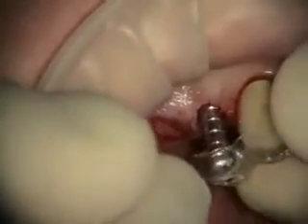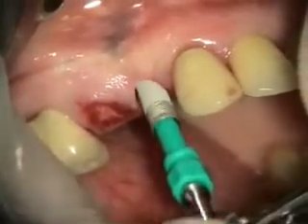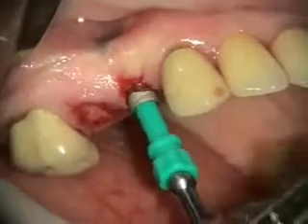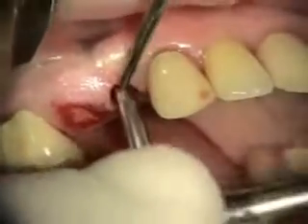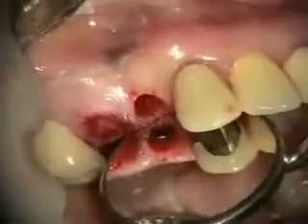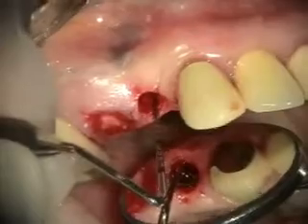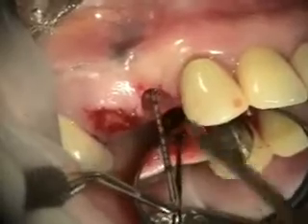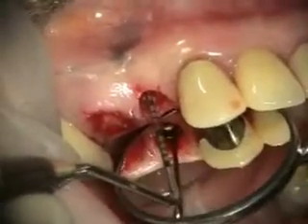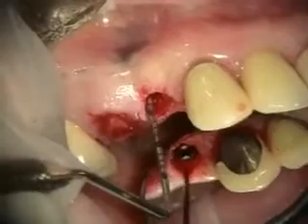You can see we're angled a bit toward the facial, and the reason why is because there's such a depression here. You see the edge of the bone is here and then the edge of the implant — it's about three and a half millimeters down, which is great. We want this to be three to four millimeters, but we'll have to profile the bone.